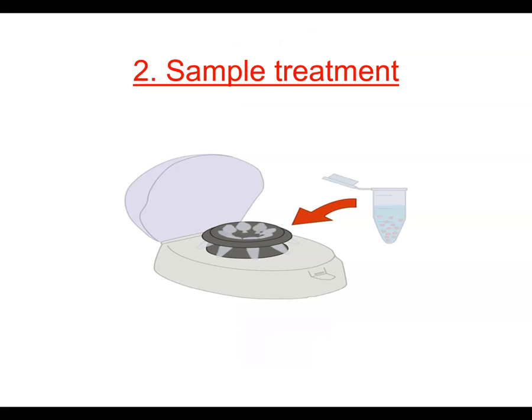The second step is that the sample needs to be treated, because the sample we get contains a lot of debris and dirty stuff. So after treatment, you need to purify the virus genome. As I mentioned, all the assays we have right now detect the virus genome. That's an indirect indication that you have the virus in your body.